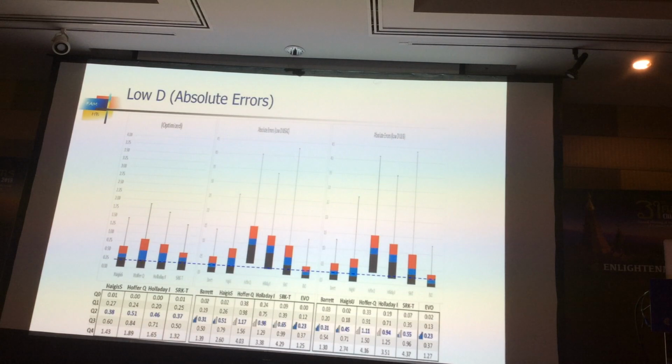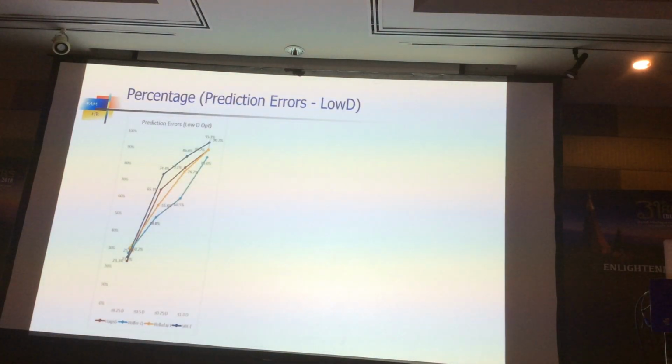You just use what is on the box. You key it into Barrett, which is available online, or Evo, which is available online. Barrett is available in our Master 700 and LenStar as well. You will not be wrong with what is written on the A constant on the box.